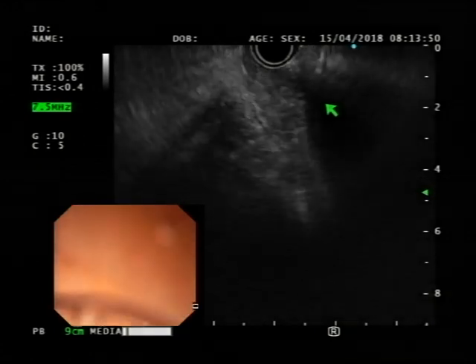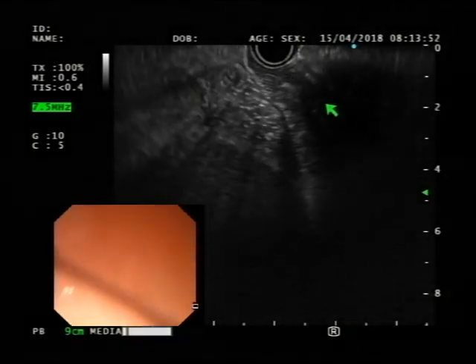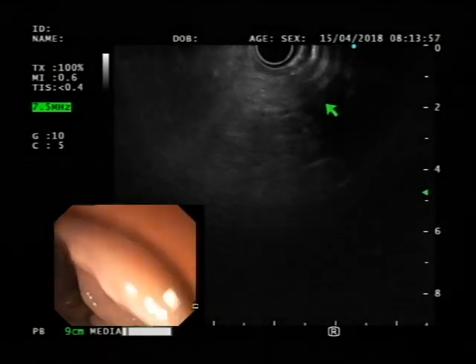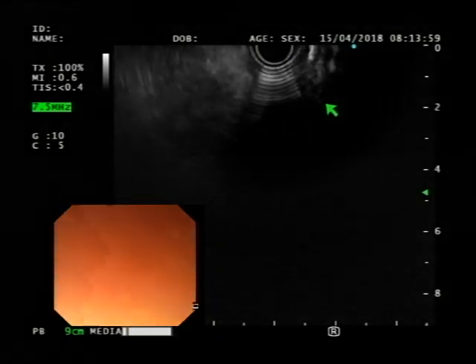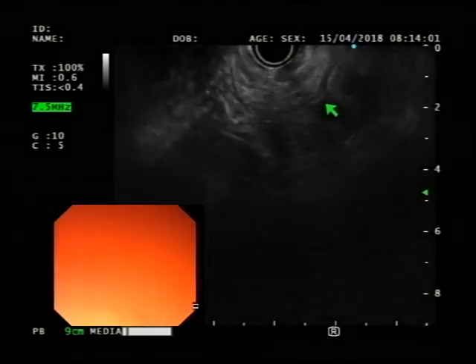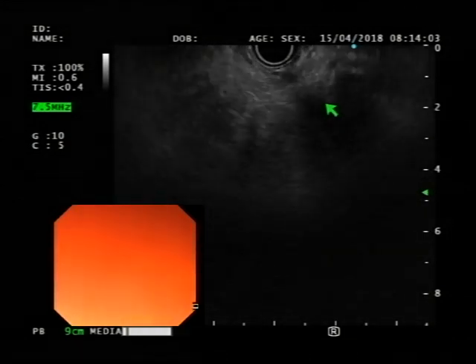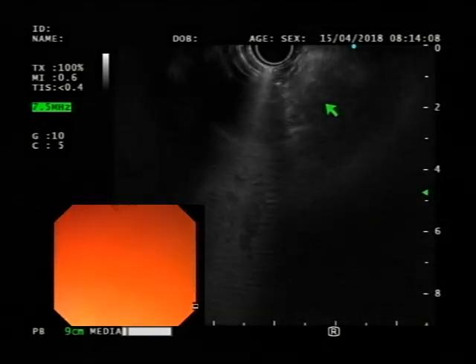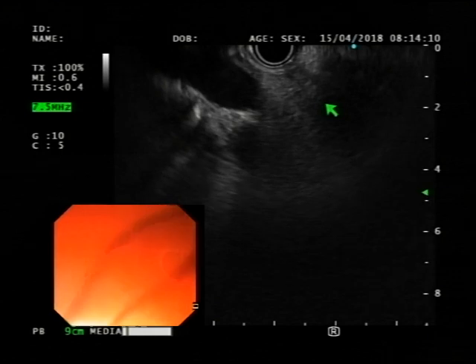Now let's start looking for the landmarks. Move a little bit away, okay. Start looking for the landmarks and start rotating and start pulling the scope back. Start looking for the landmarks. Good, excellent. Keep going. Keep rotating to the right or left. So here something came, right?